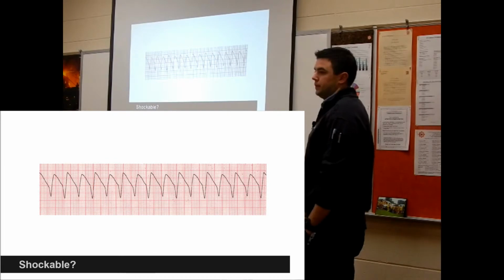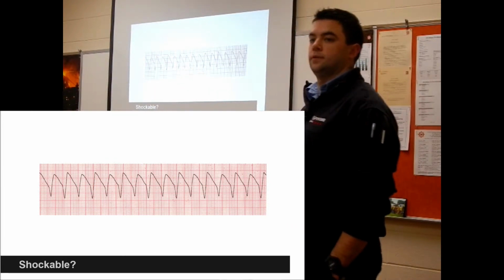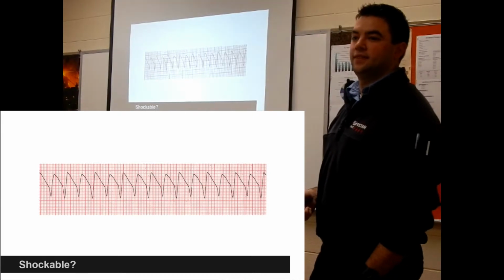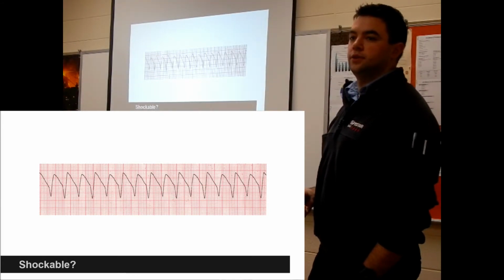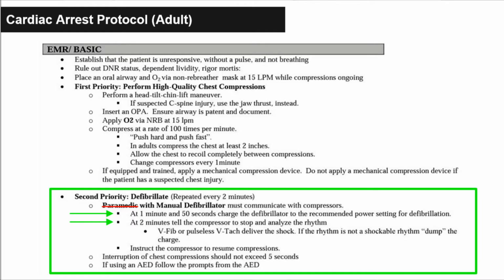How about that one? Hartley. Yeah? What rhythm is that looking like? Okay, perfect. Yep, and we're going to shock that every time. Pulseless. So here's our cardiac arrest protocol.